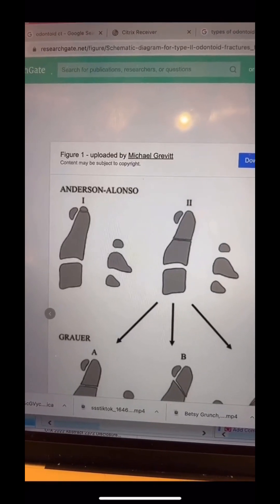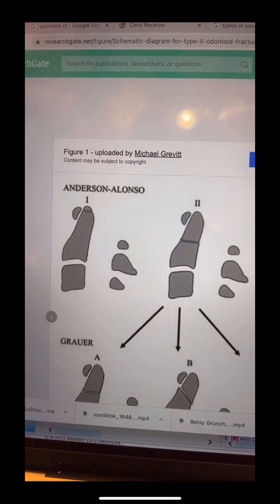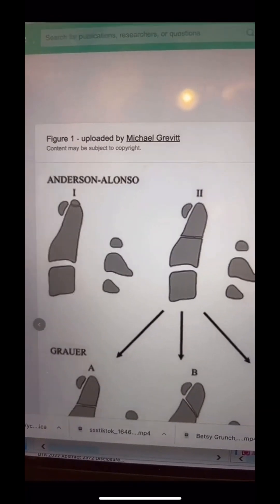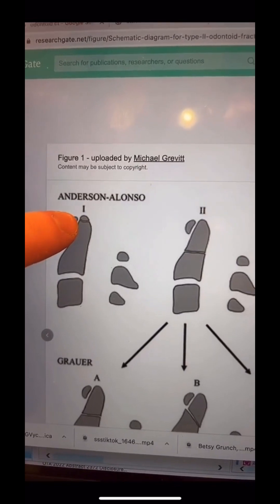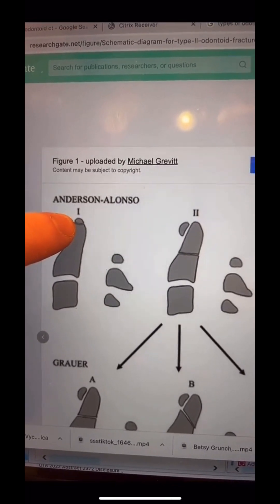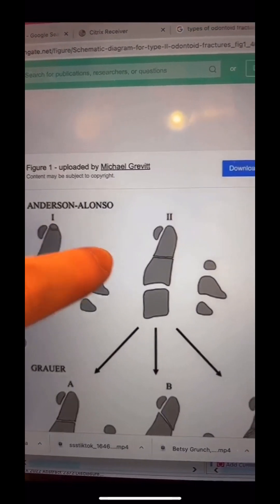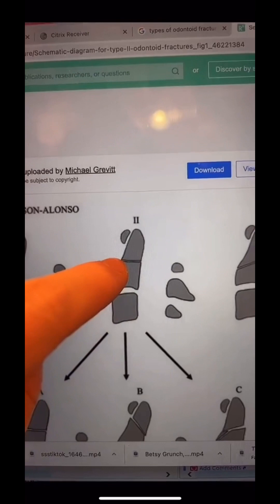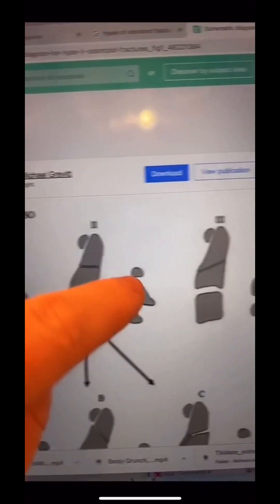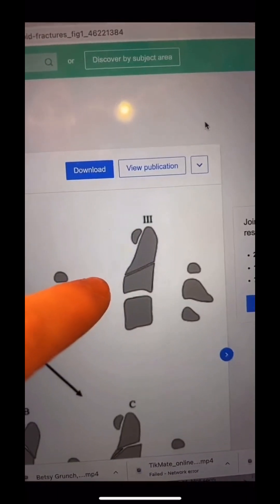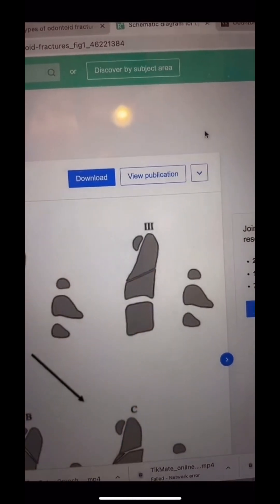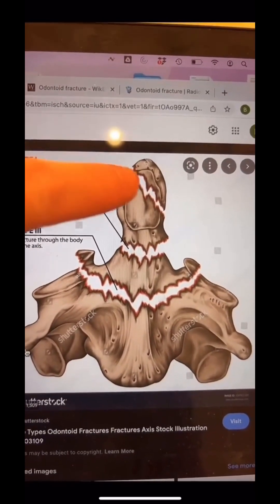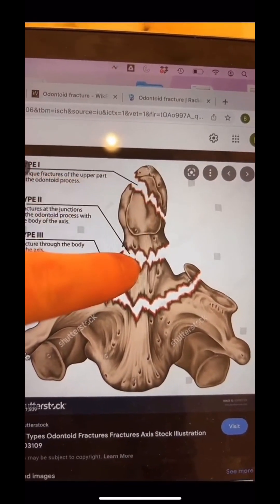The first question was: what type of fracture is it? It's a type 3 odontoid fracture. Here are the types: Type 1 is where the tip is broken off. Type 2 is where the entire dens is broken off right at the body where it inserts. And type 3 involves the body of the C2 bone. Here is an AP view to show those types — type 1, type 2, type 3.